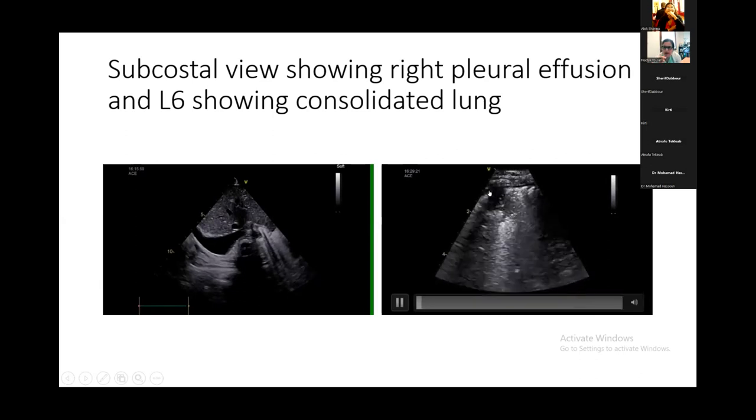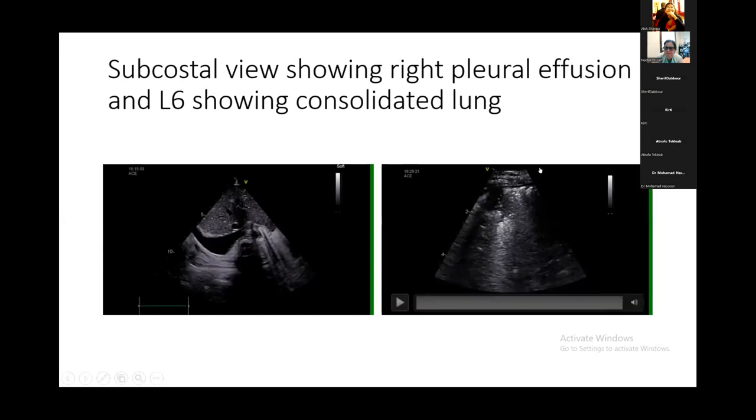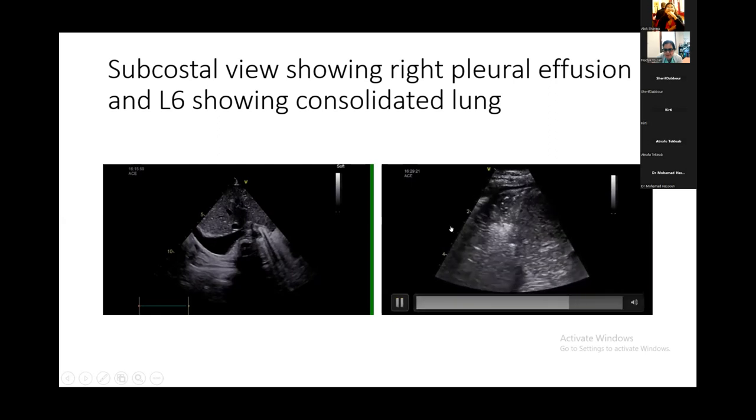Yeah, you are right. And also, if you go downwards on the clip, a little further down on the other side. You mean this side? Yeah, further up. Oh, here? Over here, if you turn the clip, you'll see it go deep down as a kind of shred sign. But it depends on how the baby's breathing. We can see it on and off. Let me play it again. Yeah, you can see here, it goes down every time. But further, deeper down, not necessarily deeper in the clip. So probably yes. Here. Yeah. Oh, thank you.